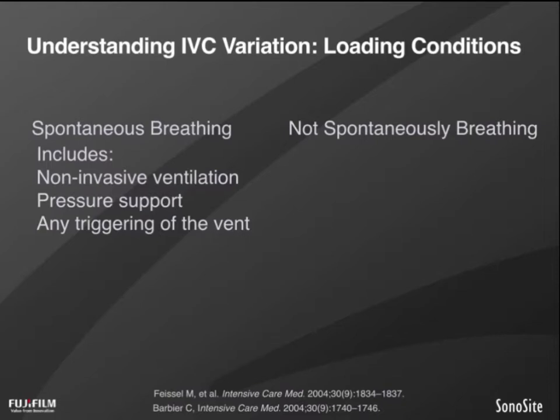So those who are spontaneously breathing includes, unfortunately, most of your patients. Spontaneously breathing, of course, room air, nasal prongs, face mask, but also non-invasive ventilation, such as CPAP or BiPAP, as it's commercially known. Pressure support ventilation in the ICU, any triggering at all of the ventilator is a spontaneously breathing group, making the IVC of unclear value.